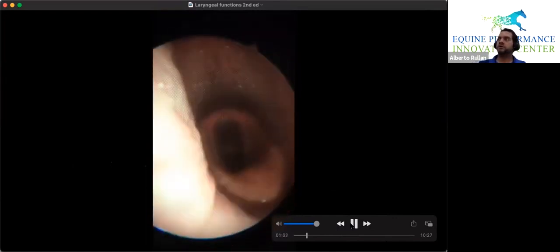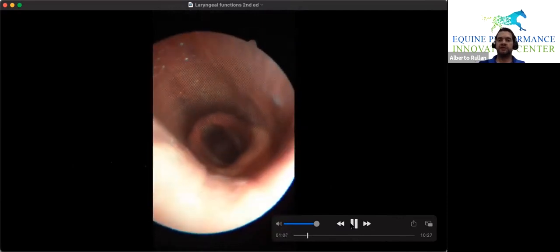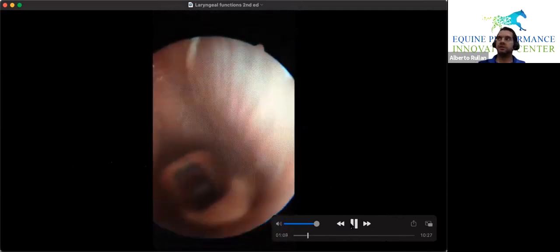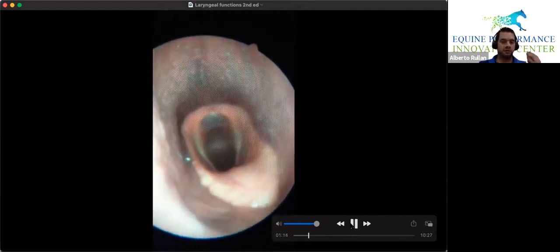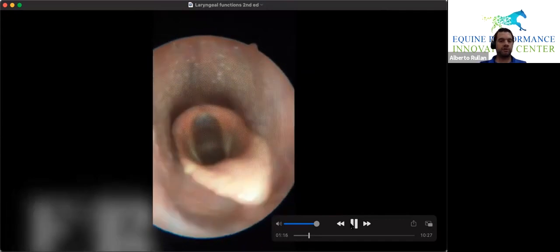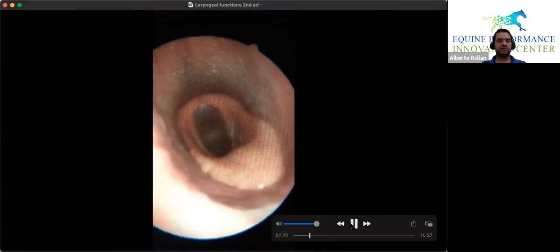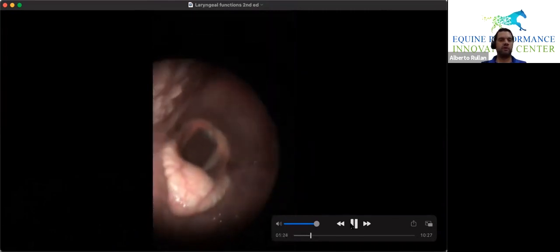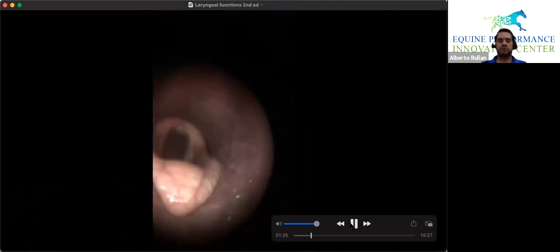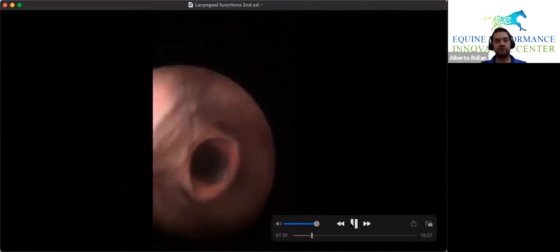So this is a good epiglottis. Now look at the anatomy of this larynx. It's a little bit different. It's a little smaller, but still opens very nicely. It has an epiglottis that is robust. It's just not as big of a throat as the other one, but overall a very good throat. Meets condition of sales, all good. Some clients and some buyers do not like small throats.